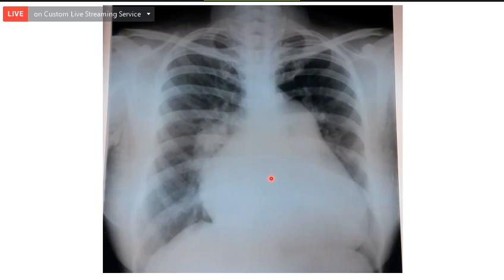So here, we have found that the right atrium is enlarged. We also found the pulmonary segment is prominent. There is a cardiomegaly. There is no left atrial enlargement. Okay, then what else? Peripheral pruning is there, sir. Doubtful. You can still see vessels going outside. I will not fully agree with the pruning because I can definitely see vessels which are reaching the periphery.